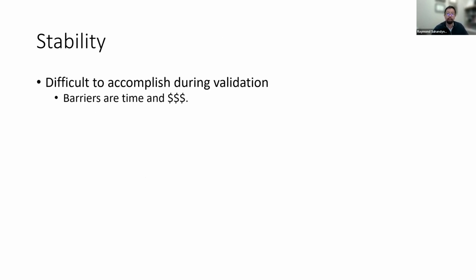Stability does matter. We did talk a little bit about that. It's difficult to do stability because of time and money. Stability studies have to be well thought out and planned, and you have to store the samples. For instance, if you are collecting samples over 4 years, how do you know your analyte hasn't changed from the first collection to the last collection? The only real way is to prospectively know that you're going to be collecting samples, which you would presumably know if you've designed a study, and to spike in a known amount of your analyte at the starting point of the study and continually monitor it, at the storage condition you have your actual patient samples at, for instance.